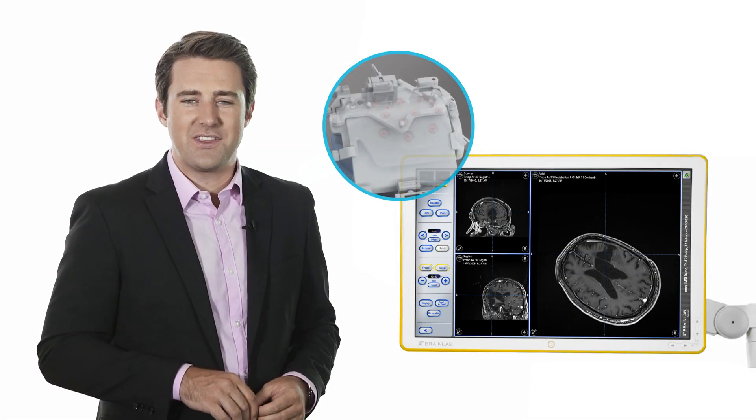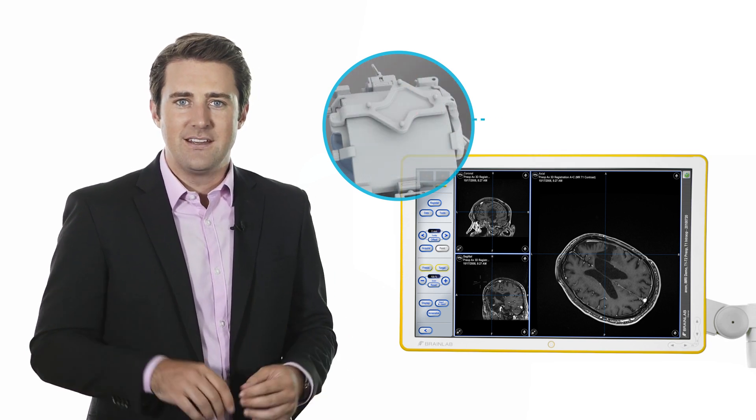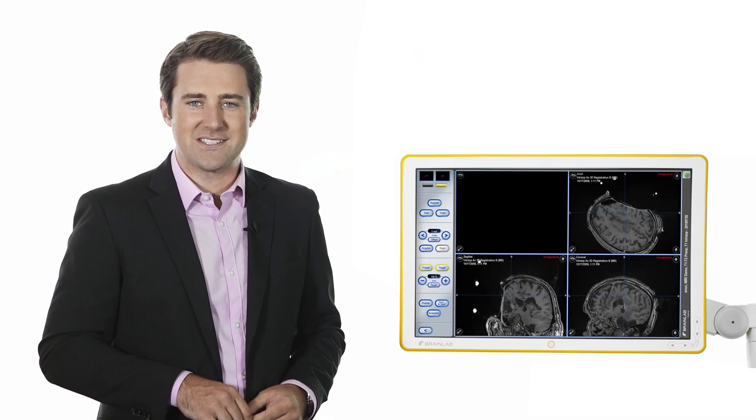Images are acquired with the MR markers included in the scanner's field of view. Immediately after the scan, data is automatically transferred to either a ceiling-mounted or mobile navigation system.